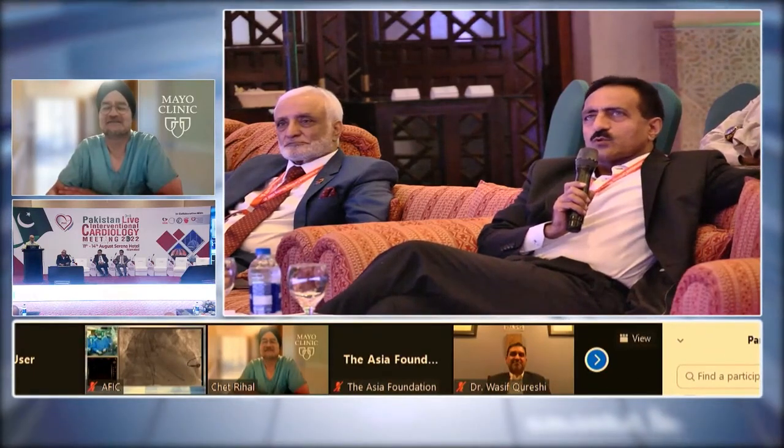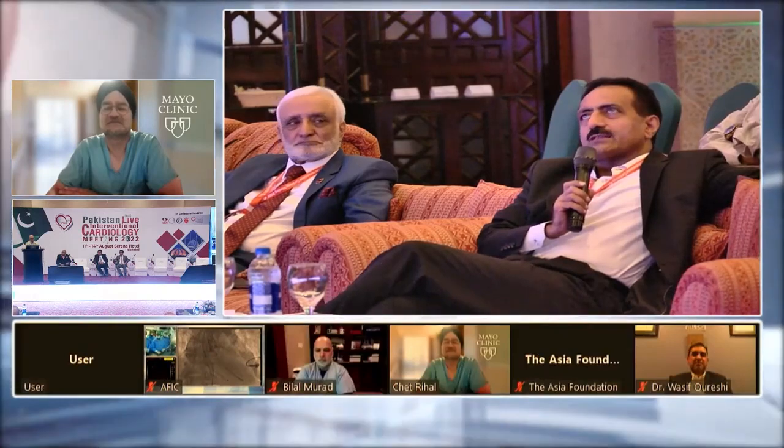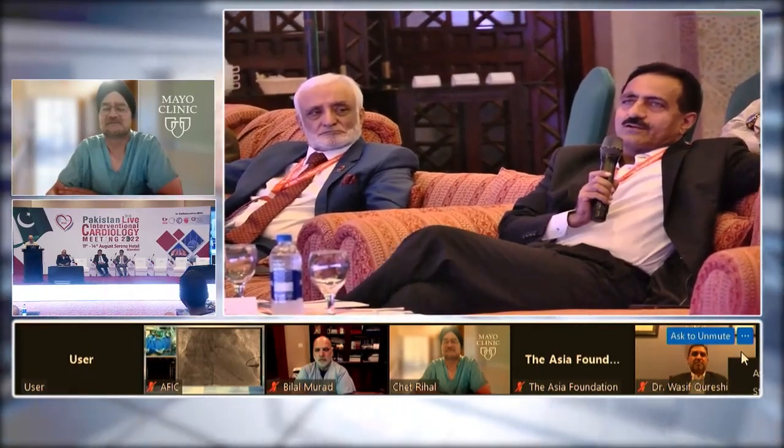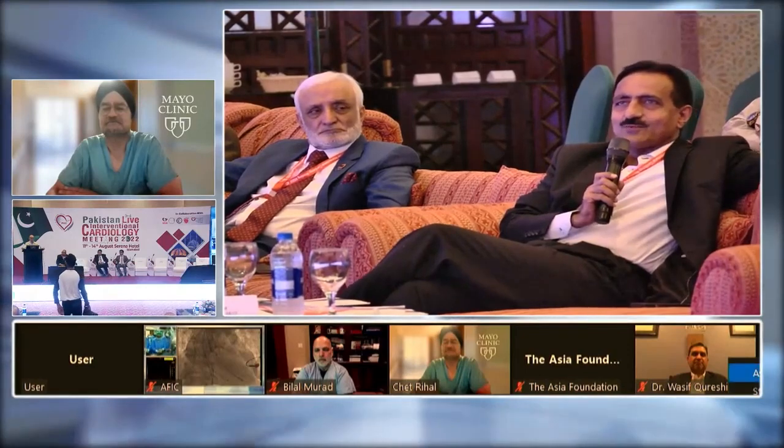Just one quick question. Just like TAVI, do you think valves for aortic regurgitation or mitral regurgitation will become routine? How long do you think it will take to get to that level?